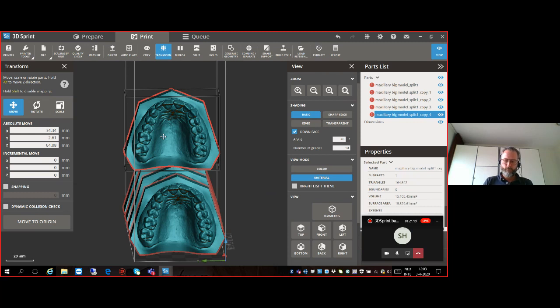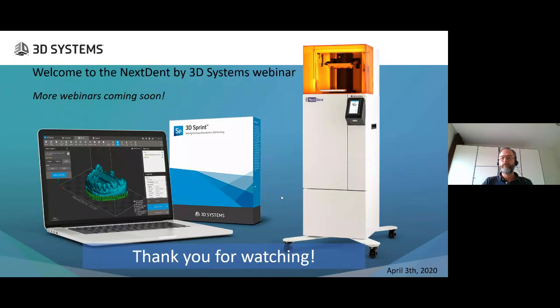Like I mentioned before, keep an eye on social media and the website so that you can make sure to attend the next webinars about the new coming features in 3D Sprint, but there will also be webinars more about the printing and finishing of dentures, for example, and other stuff coming. If you have any ideas about topics that you want to learn more about, let us know through our social media channels. We are here and we will generate the content and broadcast it to you live.